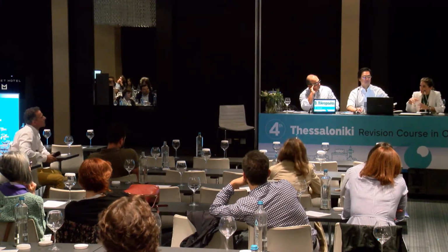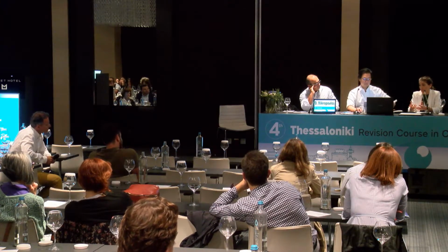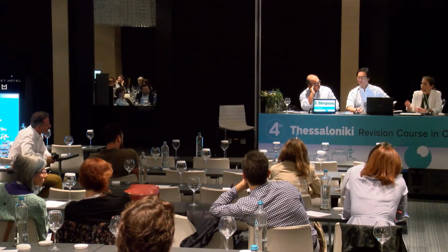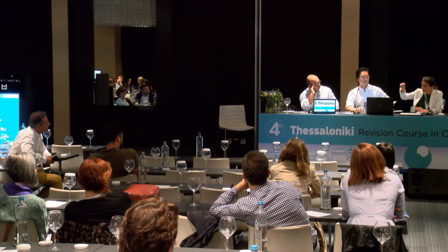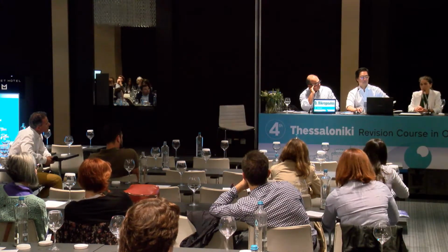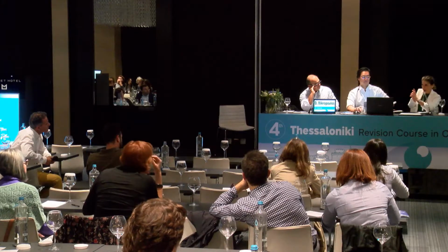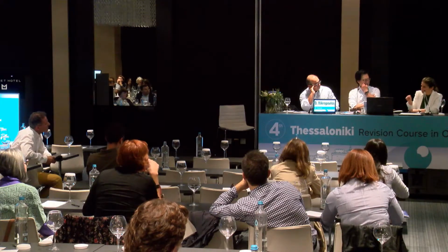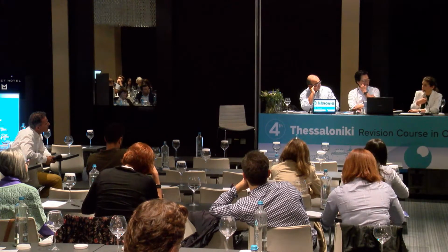The nerves which were so dysplastic, with such big PPAs, that the RNFL around the nerve is not really useful, because there is no retinal nerve fiber layer there. In these cases, the ganglion cell layer complex is very useful, because that's not affected by the dysplastic changes in the nerve. But there is a group of patients where the disc is very tilted and very difficult to assess, but the retinal nerve fiber layer is intact. In those cases, I personally find it very useful to do the RNFL OCT and monitor them with that.